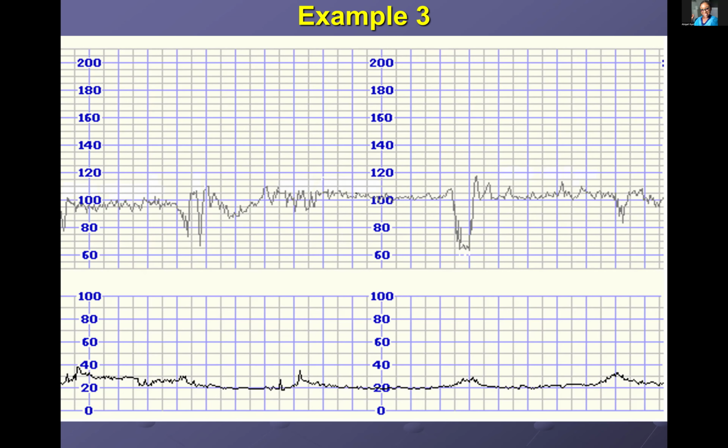Prof, I don't see any accelerations. Other people might have thought that these were accelerations, but these are not accelerations, because what are they? And so if we go for our D, what would this be?